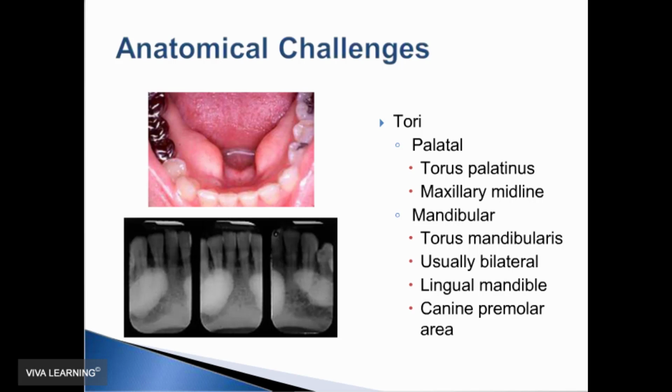And here on this example, you can see some very large bilateral mandibular tori. I've had a few patients where they come together and there's really not even a space here. So we want to place the receptor close to the tongue, and I would say have the patient lift the tongue, or preferably I just retract the tongue and place the receptor edge where the tongue attaches to the floor, and then as the patient slowly closes, the floor of the mouth will drop and will accept that placement. A size 1 receptor might work better in this instance, at least for the incisor view.